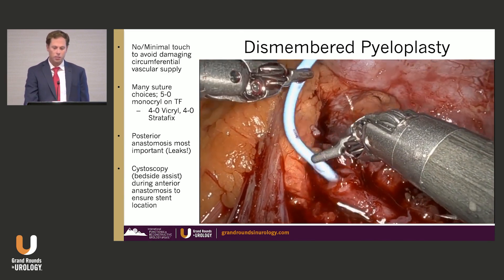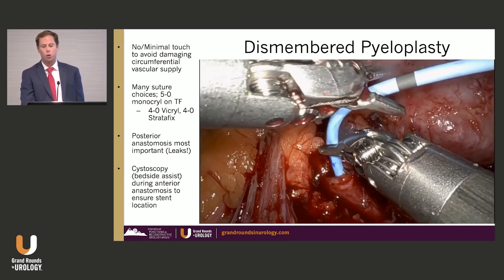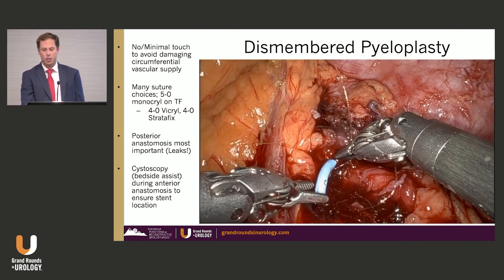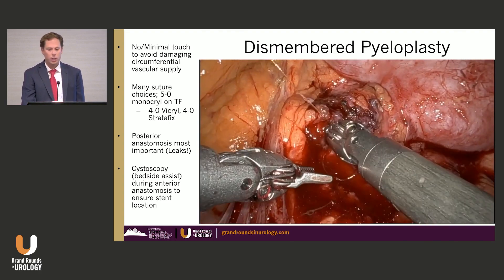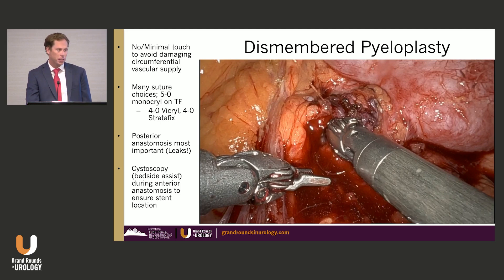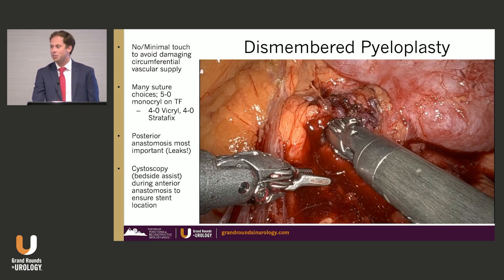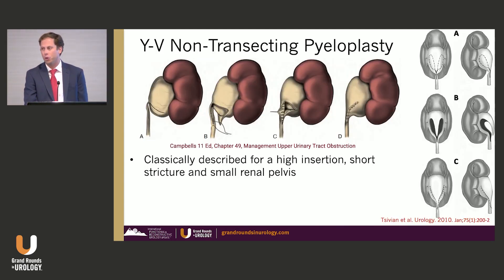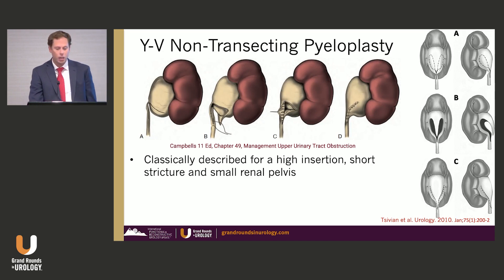Once the posterior stitches are down, it's a bit easier as you can use the suture for traction. Here we've just passed the stent down, and after it's appropriately placed we'll finish the anterior portion of the anastomosis. I typically like to have the bedside assistant do a cysto before the end of the case to confirm the stent is down. You can still adjust it while doing the anterior anastomosis — otherwise you'll have to go fishing for it or do ureteroscopy to retrieve it later, which can be difficult.